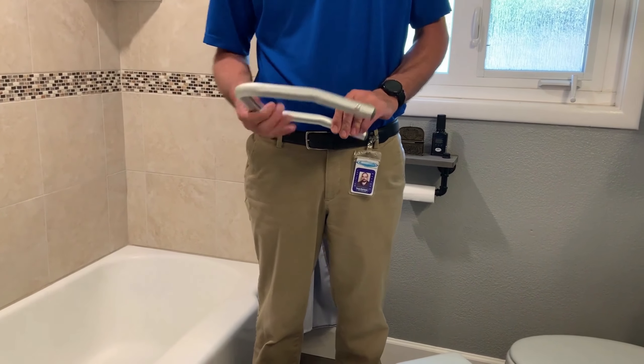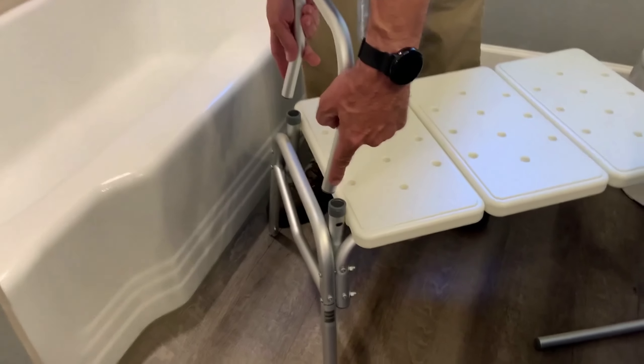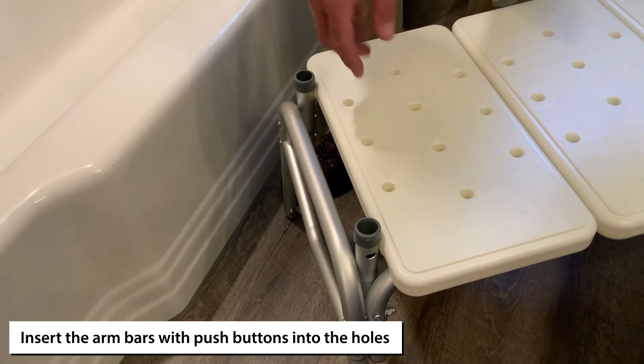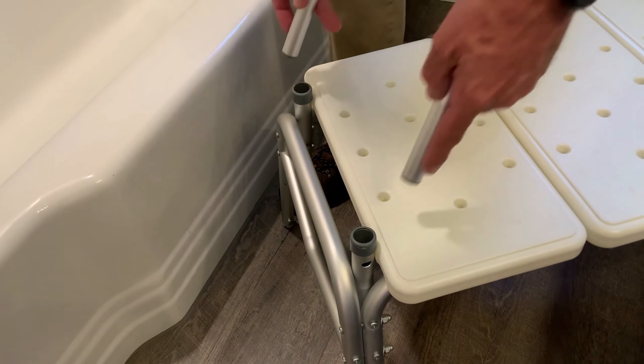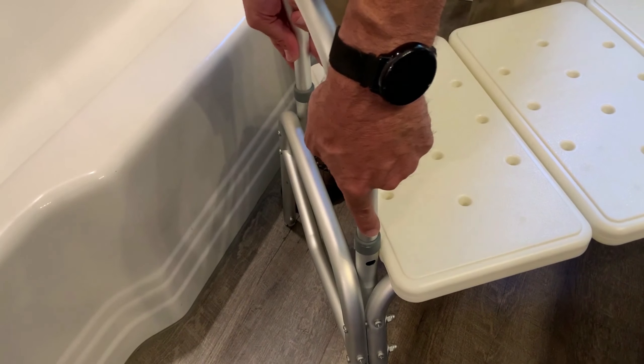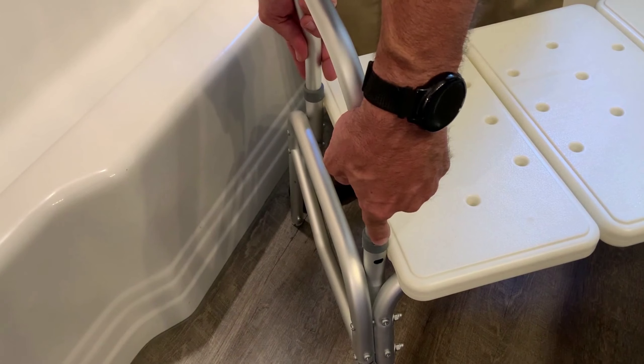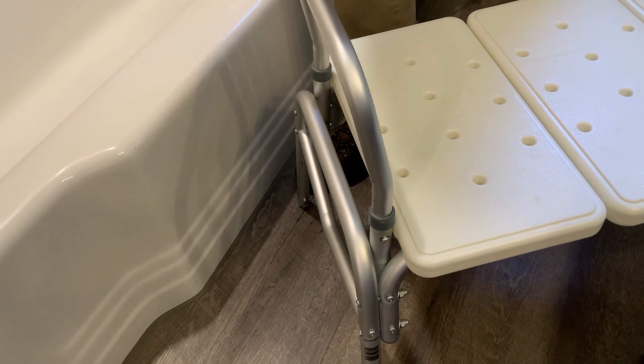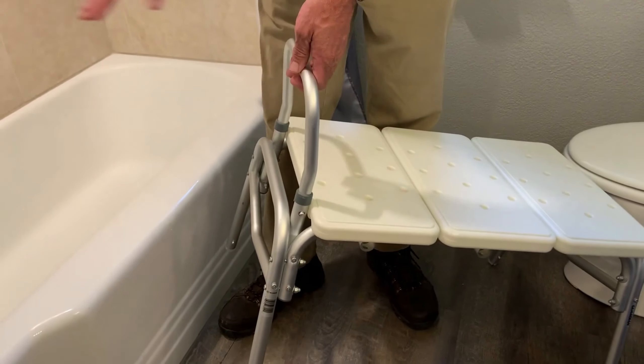We're going to start with the arm bar — this will always go right here. You have two push buttons, one on each side. Push into these holes: as you push down, you push in. You want to make sure you hear it lock into place, just like that.